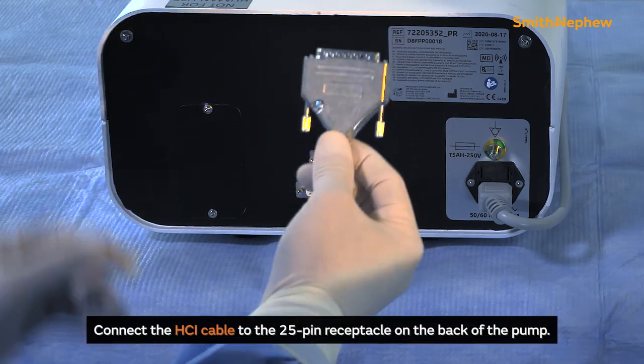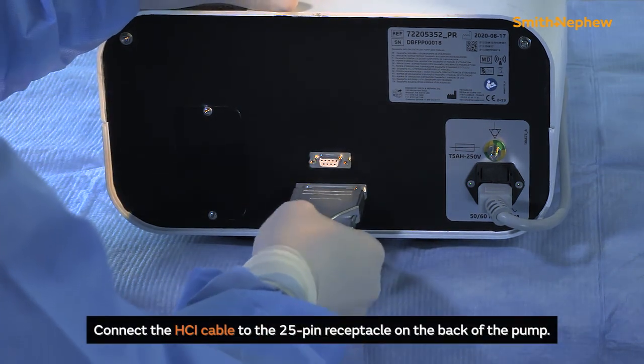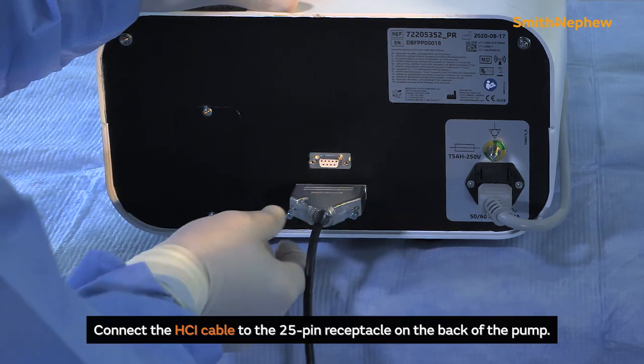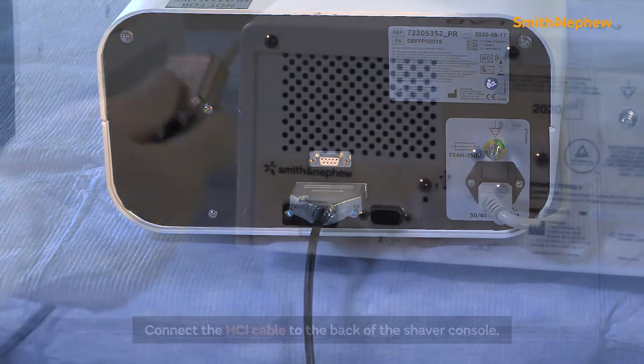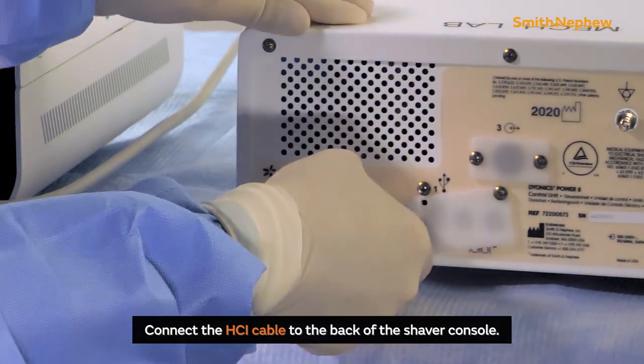When using the DoubleFlow pump with the D2 shaver handpiece, connect the HCI cable 25-pin connector to the 25-pin receptacle on the back of the pump. Connect the HCI cable to the back of the shaver console.